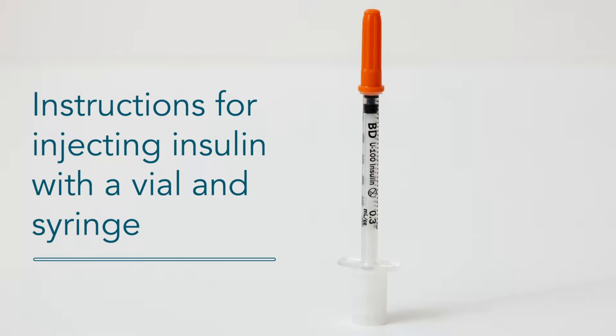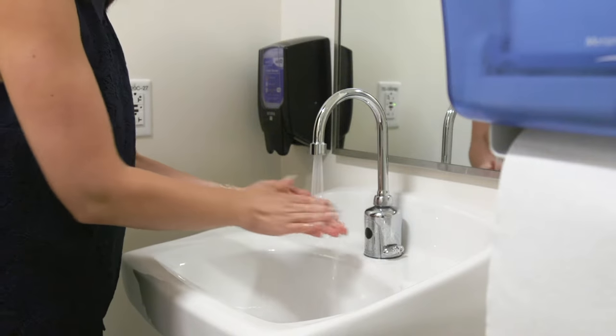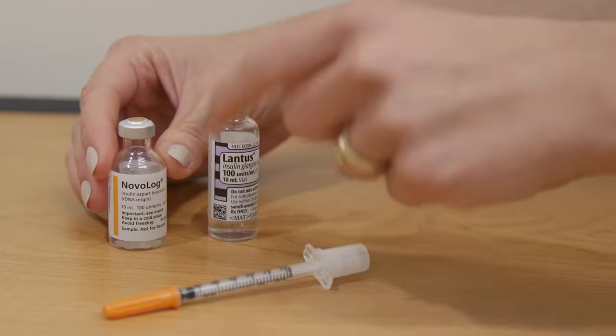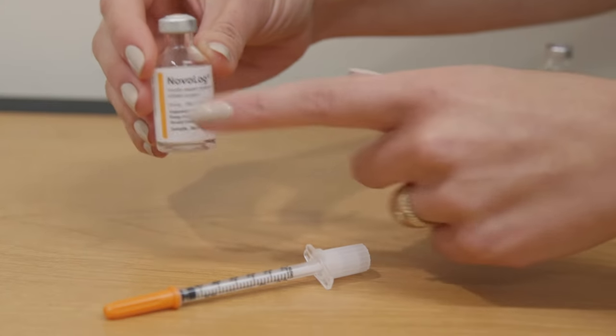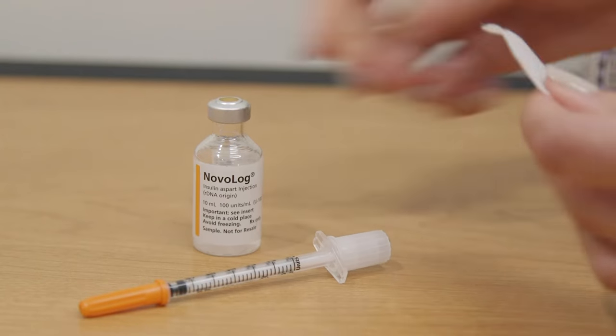Instructions for injecting insulin with a vial and syringe. Always start by washing your hands. If you take two insulins, check the vial label to make sure it's the insulin you intend to inject. Remove the cap and wipe the top of the vial with an alcohol swab.